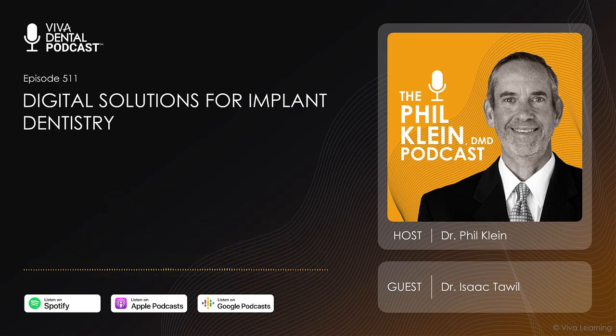So we utilize that technology tremendously. Print those surgical guides same day if need be. For that to be done, we need an intraoral scanner and then a 3D printer along with the CBCT.